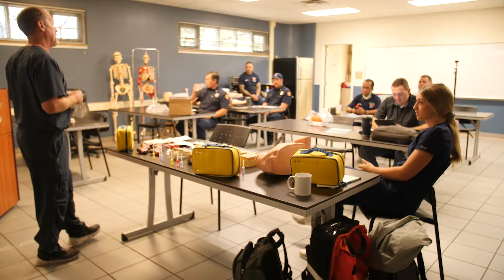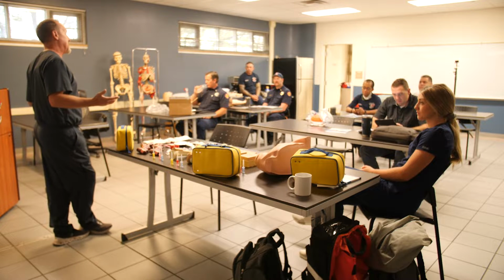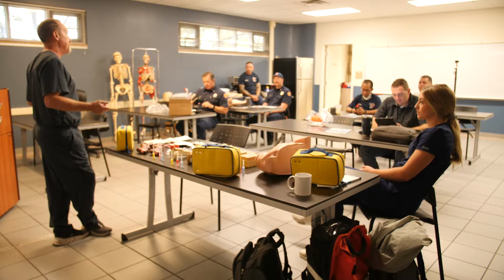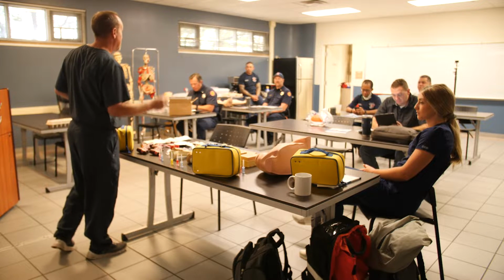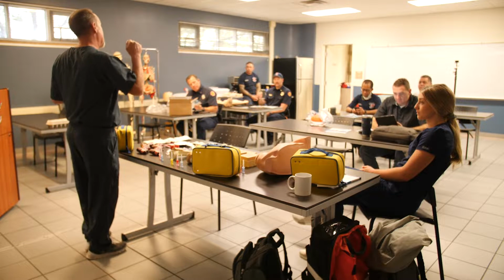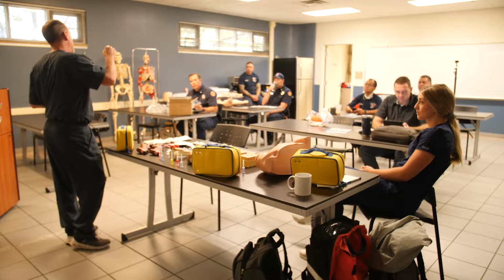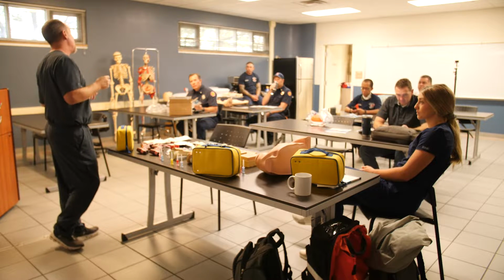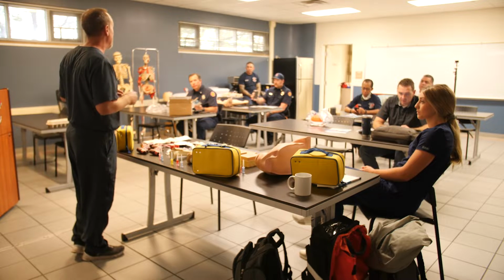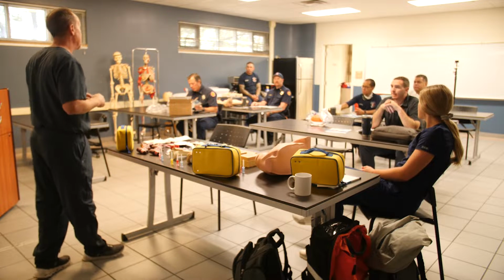Notice I didn't mention anything about osteoporosis or any sort of poor bone quality. Obviously, when you have a patient out in the field, you can't look at them and know what their bone quality is like. The needle is specifically designed to cut through bone. It makes a very precise hole into the bone, and it allows for that catheter to fit in perfectly snug, okay? It doesn't cause bone fractures. We don't have any known incidents of any problem like that. So any questions on the indications and contraindications?